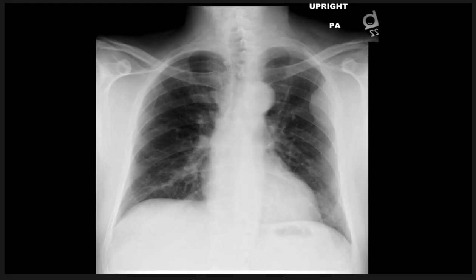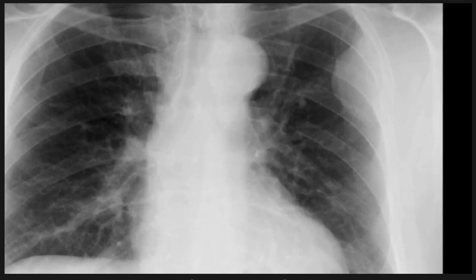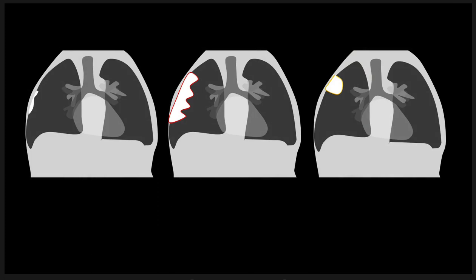This is another situation here. Get a zoom in where we've got a mass. This one's not as large in the up and down or craniocaudal span, but it's still mass-like. You can't let that go. This has to be followed up with some cross-sectional imaging.